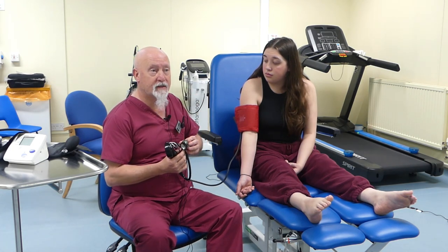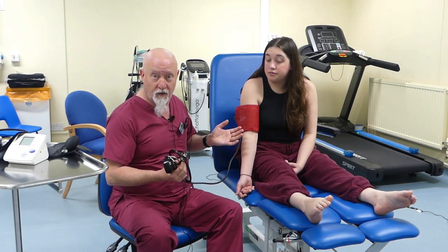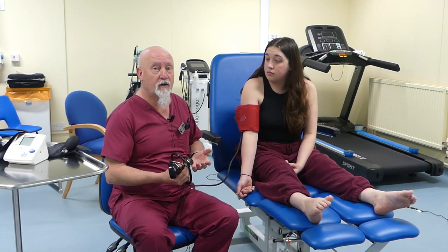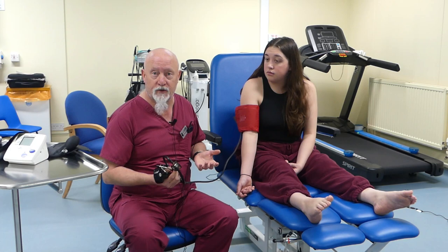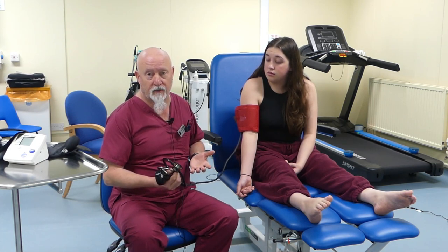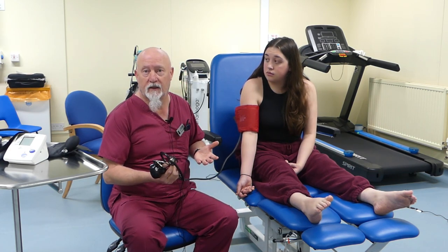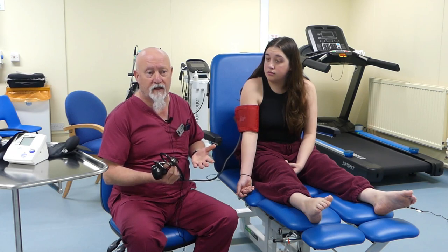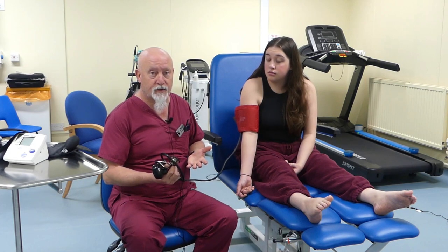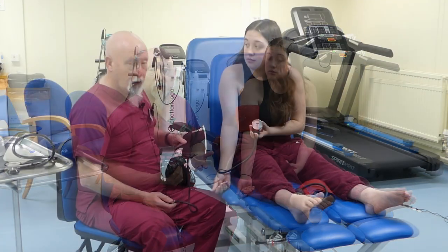You'll be expected to give a reading — the reading I got here was 125 over 80. Then you'd be expected to interpret that, whether you feel it's in the normal range or abnormal, and discuss that with the tutor, which you should get from your notes. Blood pressure increases slightly with age and it is a very personal thing — some people have higher blood pressures. You're really being expected to do a resting blood pressure.